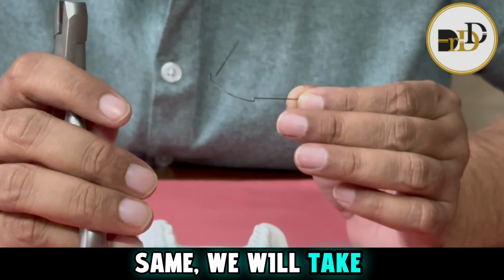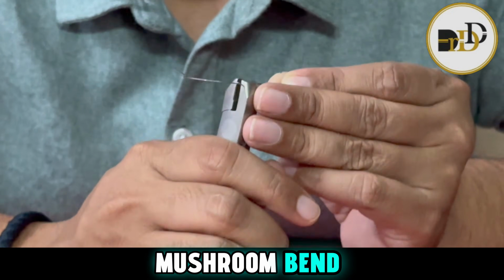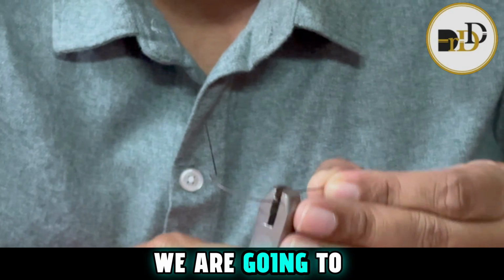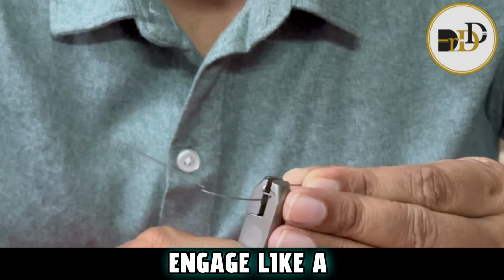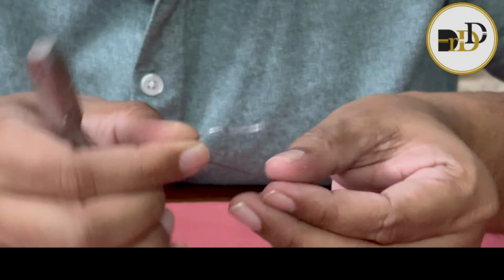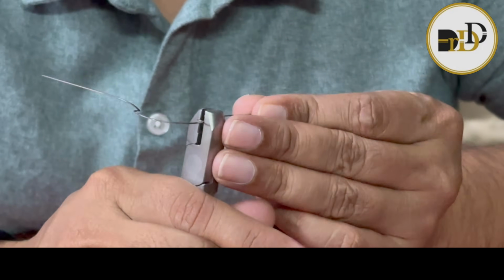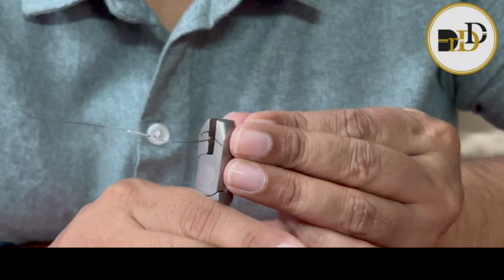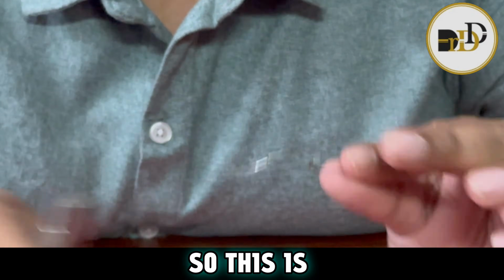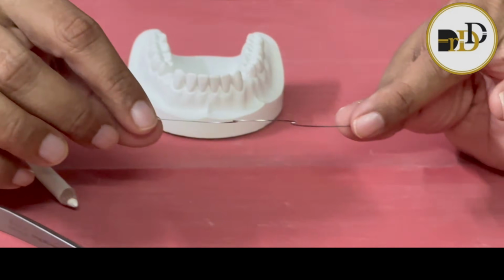Same, we take the De La Rosa plier, and after the mushroom bend which we have given, we engage a smooth curved horizontal compensation bend like this. So this is the horizontal compensation bend.